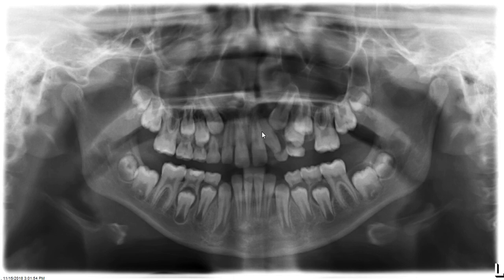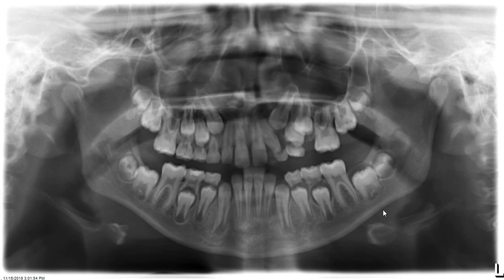Another area we need to pay close attention to is this region. The reason this radiograph was actually referred to me was to evaluate this particular area for ruling out pathology, including odontogenic tumors or cysts, along with an extra follicle or supernumerary tooth in this region. Take a moment to look at this region and decide whether this is most likely a normal anatomic feature, a definitively abnormal area, or somewhere in between — make up your mind before we dive into it together.